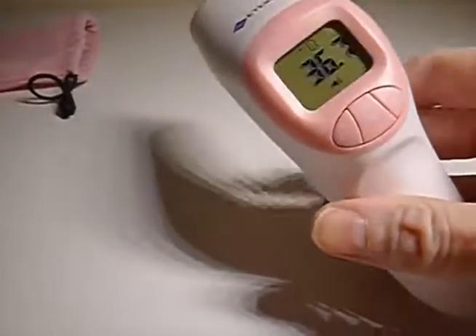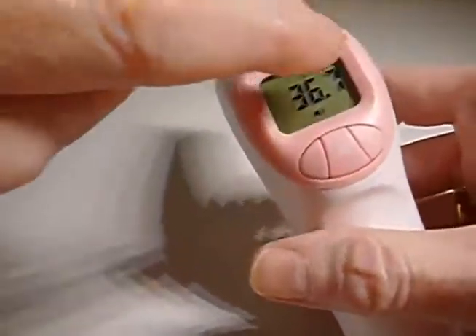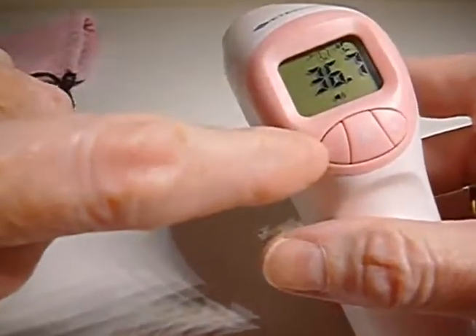Makes a slight clicking noise while it's measuring, which the camera might pick up, and then it bleeps afterwards. My forehead is also 36.7. Measures in degrees C, or it can measure in Fahrenheit.